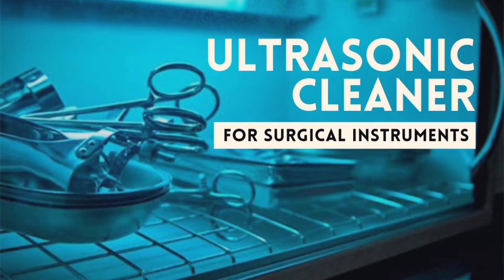Hello friends, today we're going to see about the ultrasonic cleaner machine. Let's get on to the video.